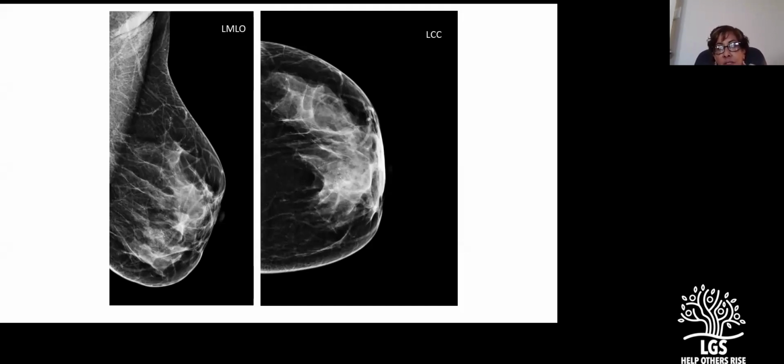Have you heard of Dr. Tabar? Yeah, I've learned most of my mammography from Tabar.